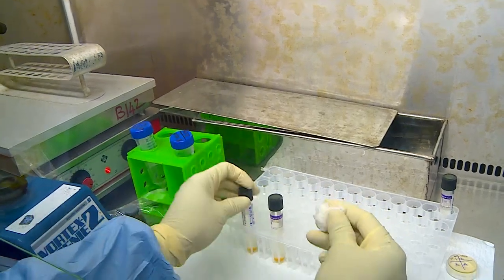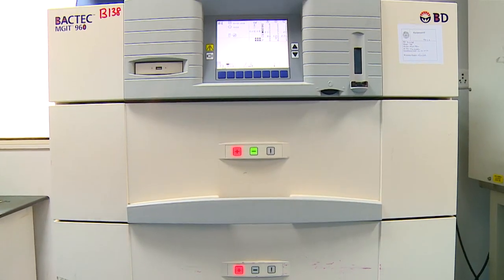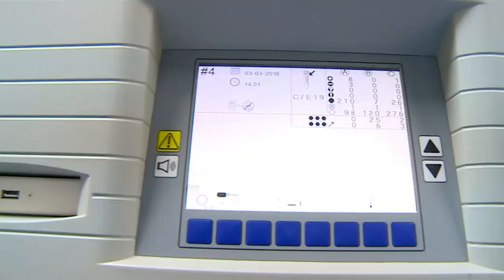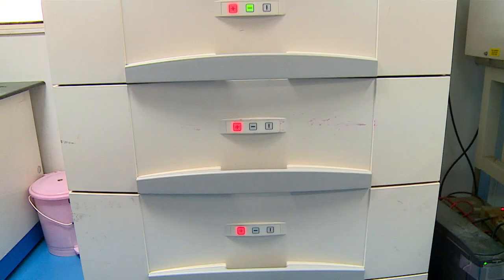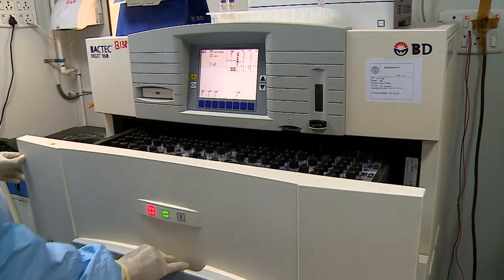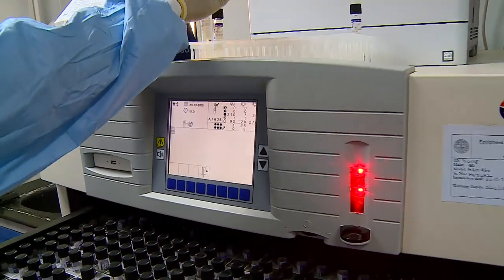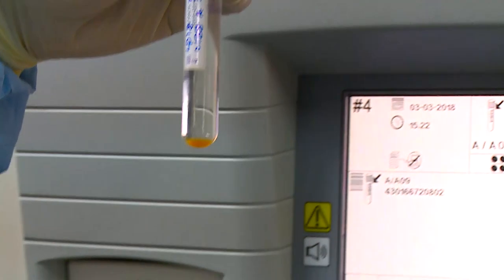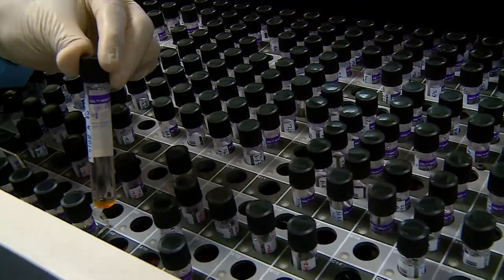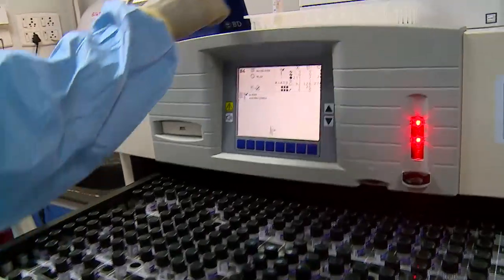Before removing them from the biosafety hood, the external surfaces of the tubes have to be wiped with disinfectant. This is the BACTEC MGIT 960 system with a display screen that has user-friendly icons. The system has 3 racks, each capable of holding up to 320 tubes. One of the racks is pulled out, the insert button is pressed, and the scanner is activated. The bar-coded tube is scanned, and immediately the system indicates an empty slot with a flashing light where the tube has to be inserted, and the rack is closed.